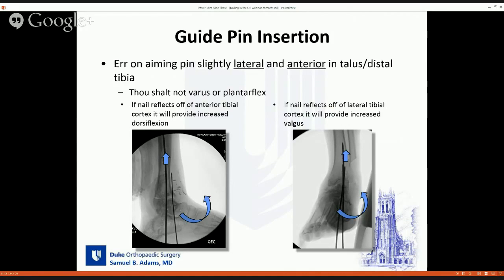The two most egregious errors are leaving the patient in varus or plantar flexion. If the guide pin is heading a little bit anterior into the talus and tibia, when you place the nail it will reflect off the anterior tibial cortex and force the foot into a little more dorsiflexion. If the pin is heading a little bit lateral, as the nail is inserted it would bounce off that lateral cortex and push the foot into a little more valgus — two positions you would want to err in for this case.